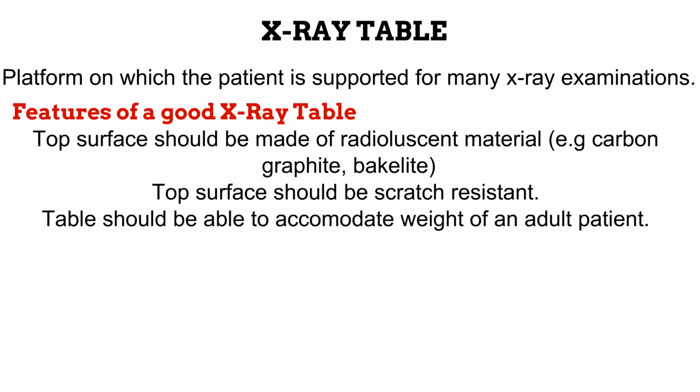It should also be resistant to scratch. This is because scratches can serve as hiding places for germs and they can be reproduced on the radiographic image during Bucky exams, reducing image quality. Also, the table should be able to support the weight of an adult without giving way. By giving way, I mean getting damaged.